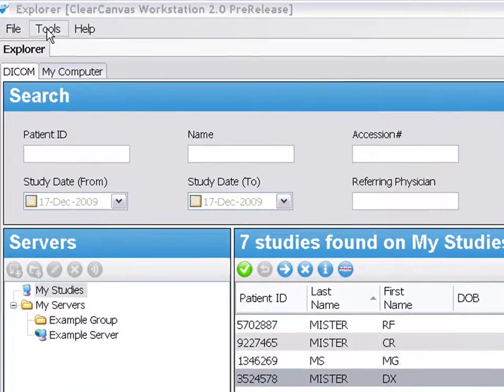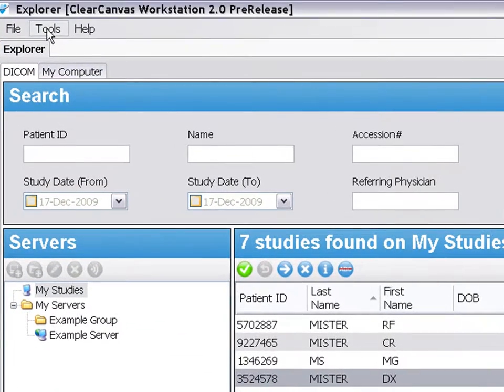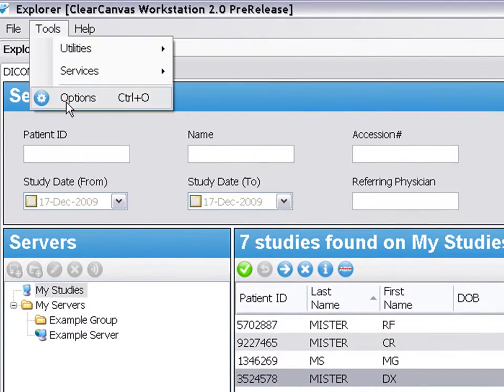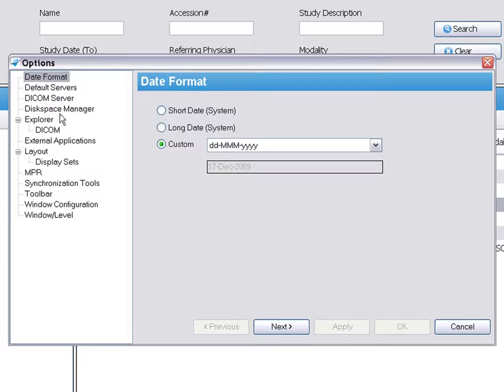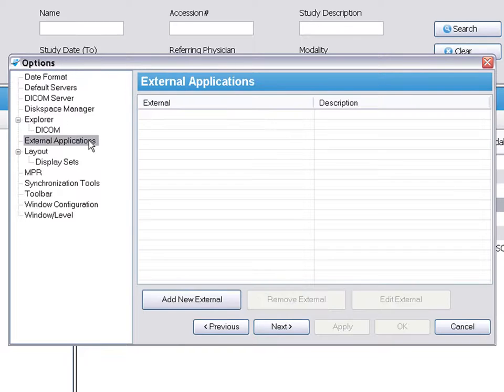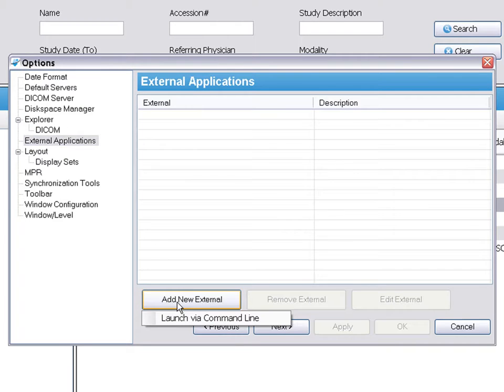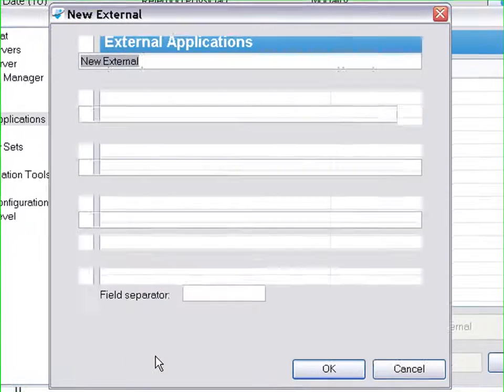To use the External Applications feature, go to Tools, Options, External Applications, and click on Add New External.